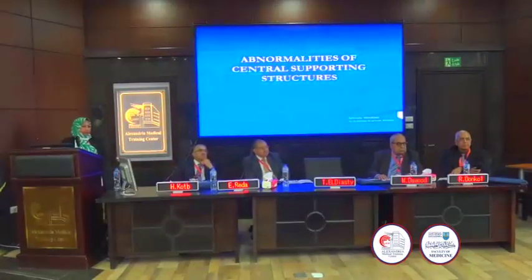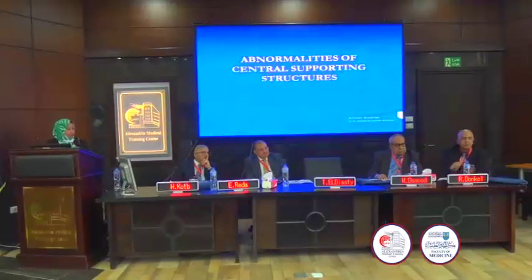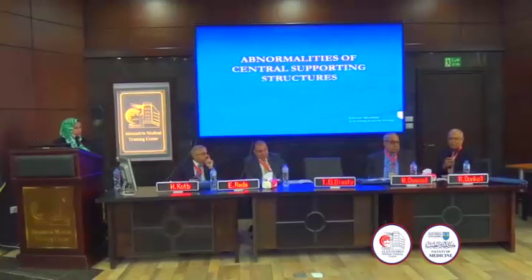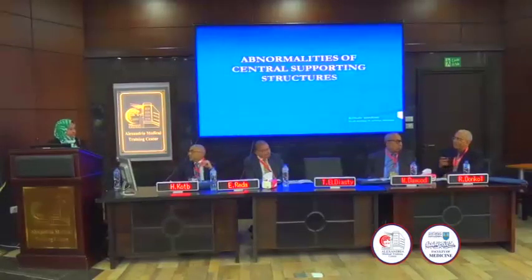So we can start with ultrasound, and if there are negative results, we can proceed to MRI. The modalities complement each other. Yes, it is complementary. All the methods are complementary.